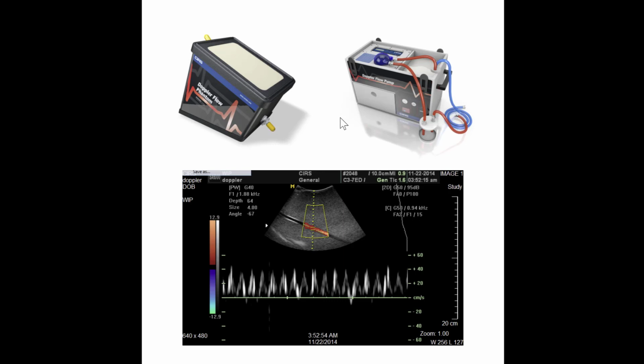You would take your pump and attach one side to one and the blue side to the other. So you have a method for the fluid to flow through the vessel out to the pump and then continue that cycle through. You can set the Doppler flow pump to different velocities. The velocities then would be known by the pump, and then you could go into your equipment and test. Did we accurately measure velocities through there? So the pump method uses fluid that is very similar to blood, uses a phantom that mimics soft tissue with a vessel running through it.